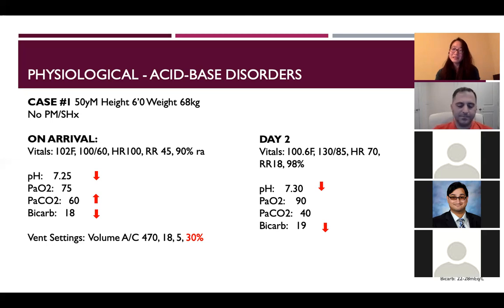So I think given the current ABG, I'd say that probably there is some level of metabolic acidosis from the sepsis, but the respiratory component has normalized, I think, because the CO2 is in normal limits. I guess the question is how long do we keep them on this vent setting versus should we try to wean them off eventually? And I don't know when you make that decision.